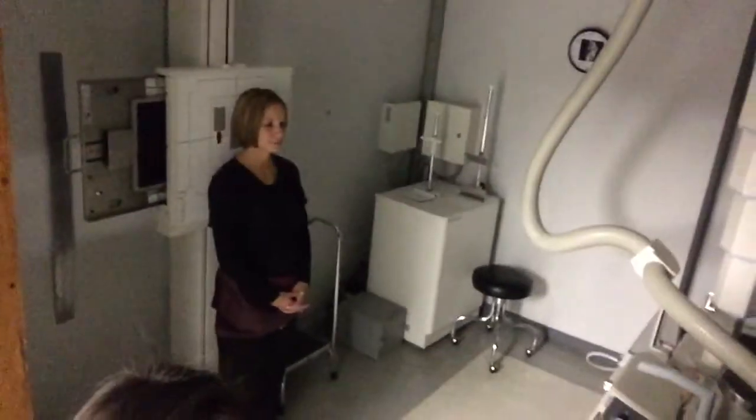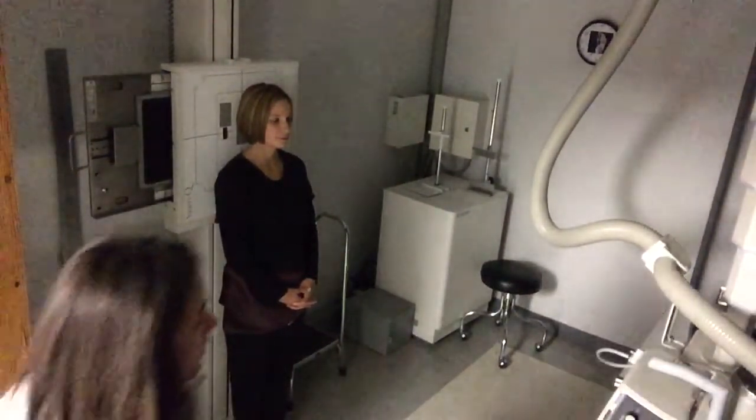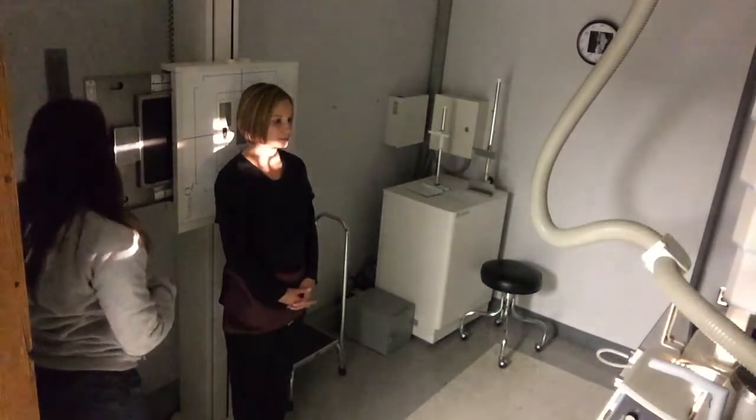not necessarily our actual Bucky. So turn that a little bit so you can see better. I'm looking at the IR here to make sure that my central ray is in the middle of that.